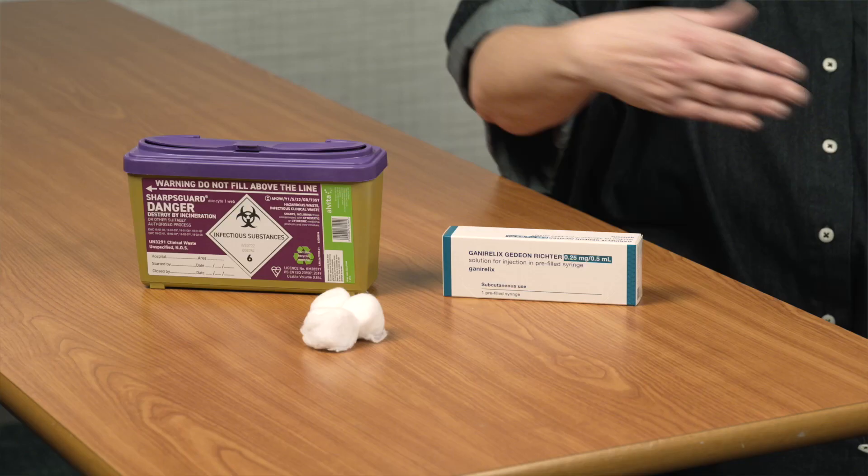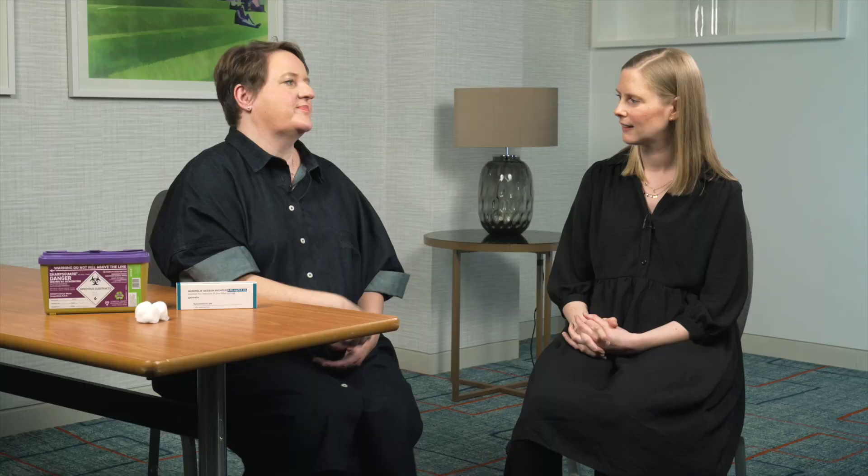Then find a clean surface and lay out what you will need including the pre-filled syringe, a puncture resistant container — ideally a sharps bin — to dispose of the used syringe safely, and cotton wool balls.